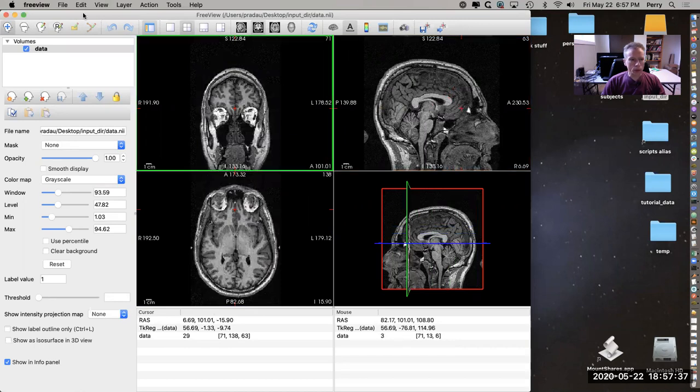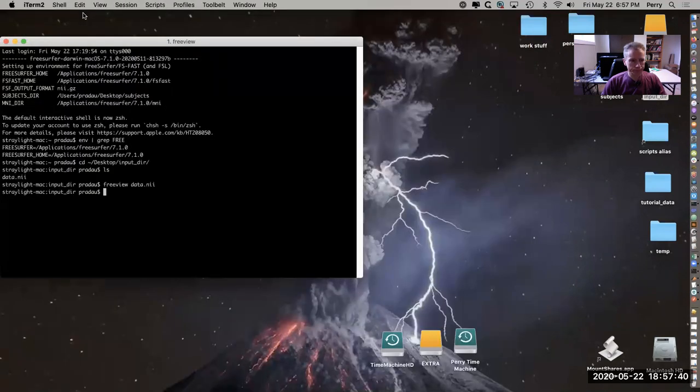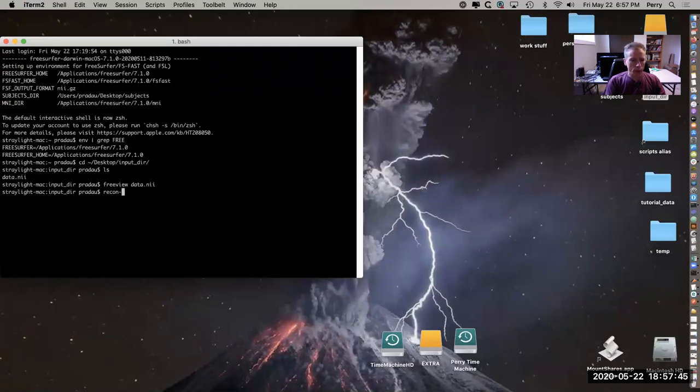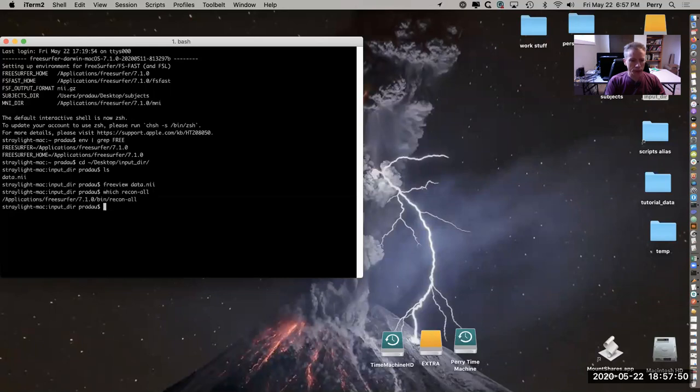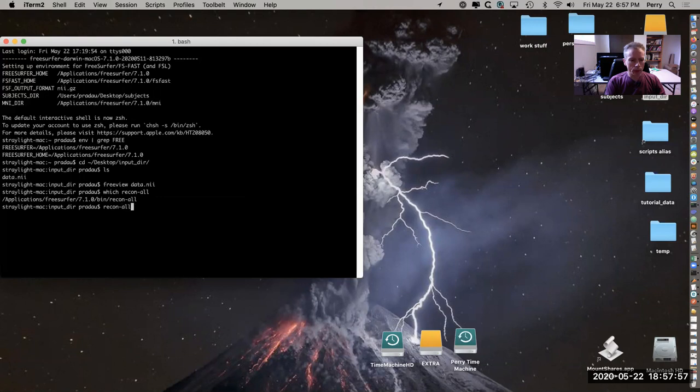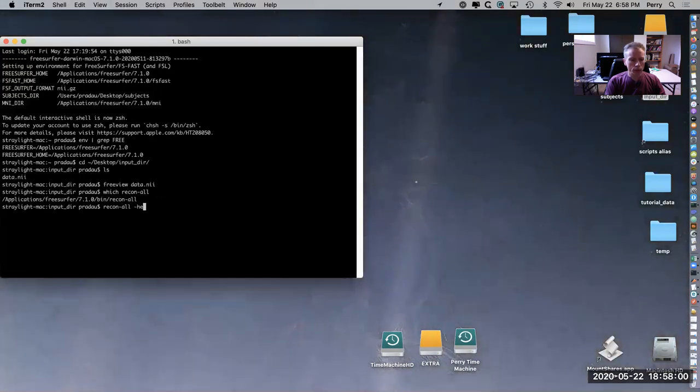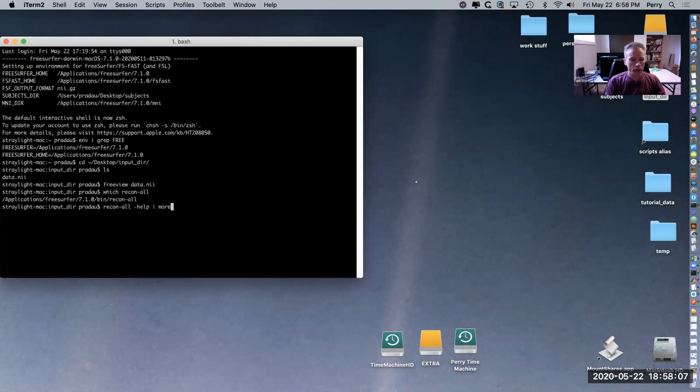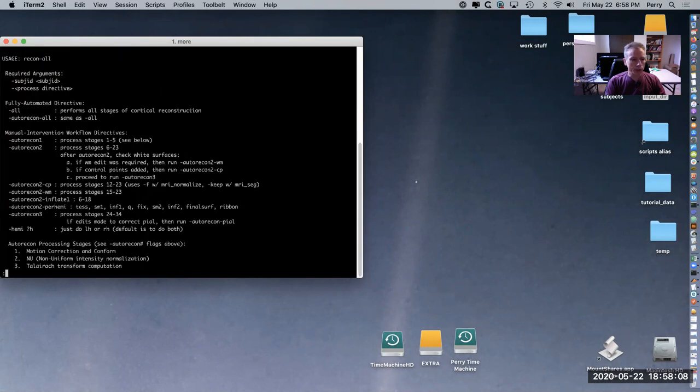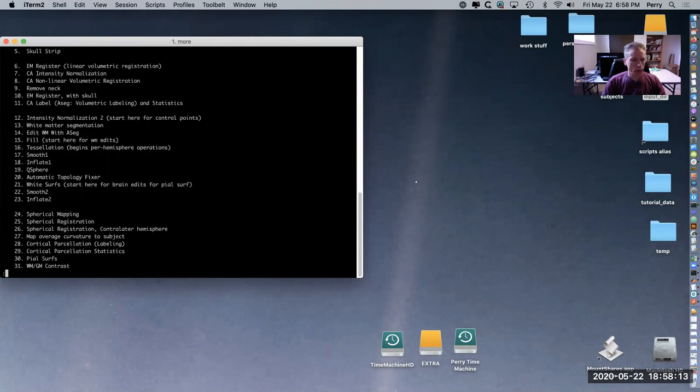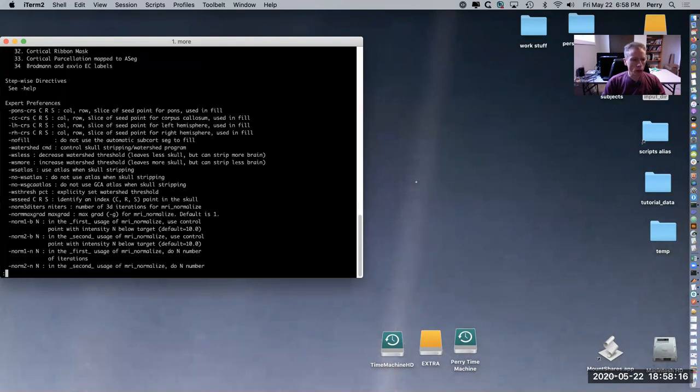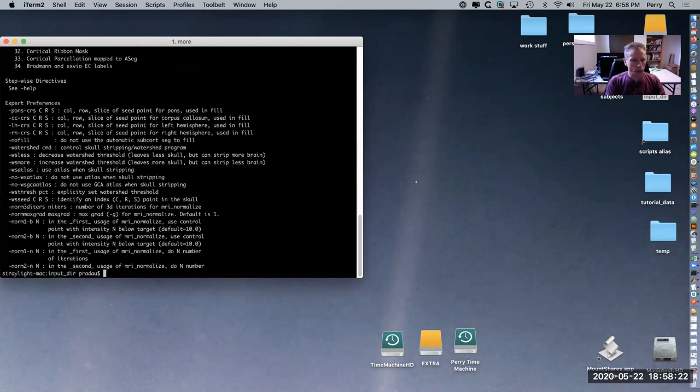We can check that recon-all is available - yes it is. If you want to look at all the details of the flags for recon-all, you can use this command. Notice that it has many pages and it's quite detailed, so you'll probably want to use the more command to page through it with space bar. There's a web page that has all this as well, but I'm just going to show you the most common usage.